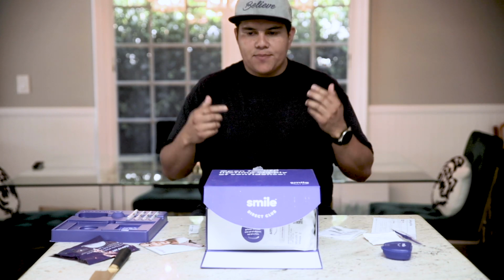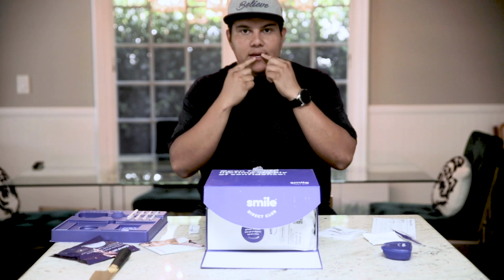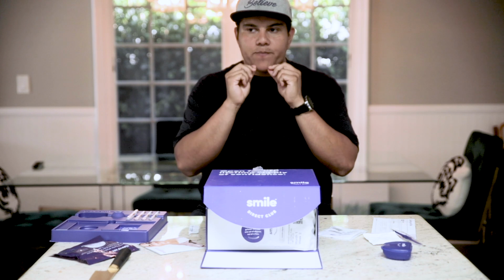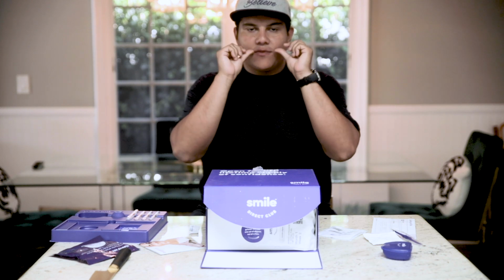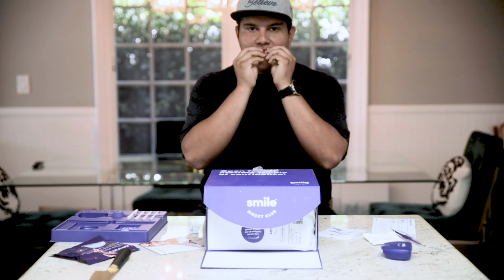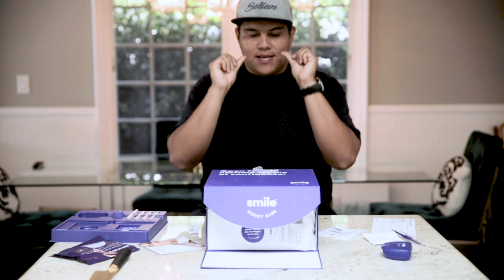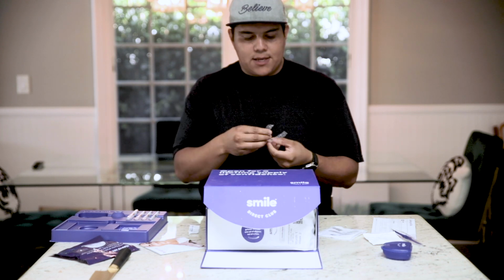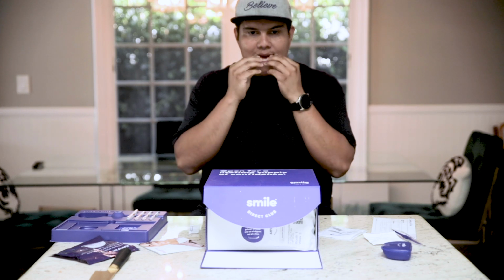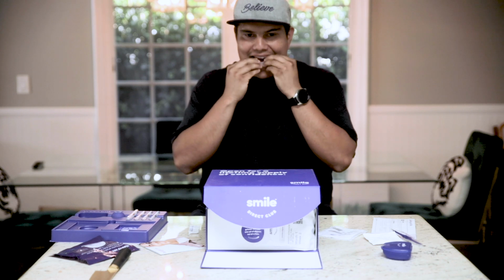After you guys saw that major fail right there in the beginning, I started with my front 2 teeth, making sure those are in. Then after that, I kind of went from each tooth and went right behind. The way they said it is basically put the front and then the back, but I just went front and then each tooth after that. So now I'm gonna try the bottom ones, and it is tight, but it kind of feels good.